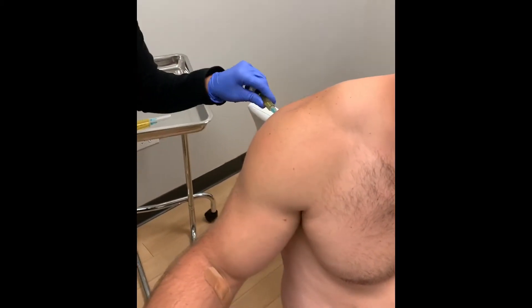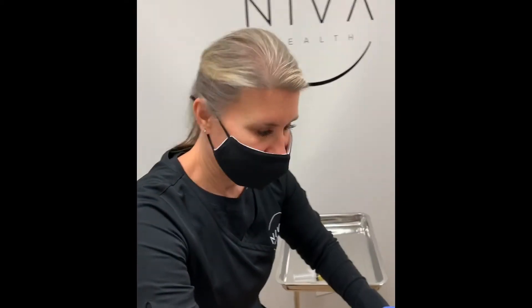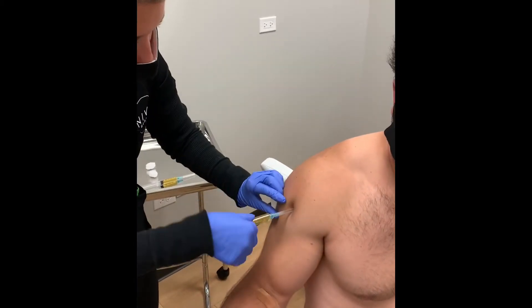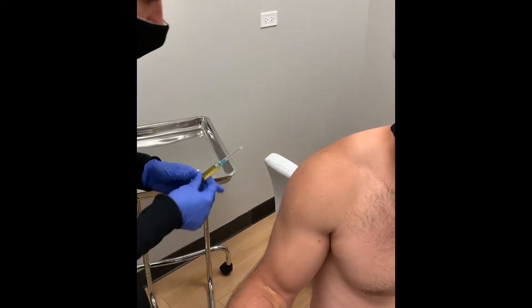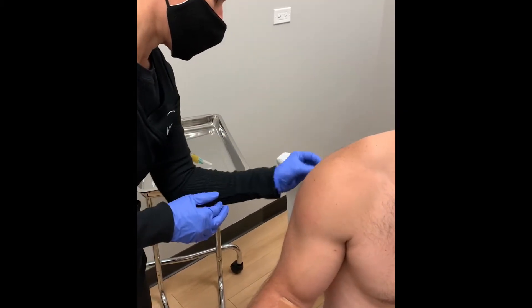This is Dr. Jason getting his shoulder injected, and Danielle, our nurse practitioner here at Neva Health, is marking the area where she's going to inject his — what we like to call liquid gold. All the growth factors, cytokines, all the things that are going to help him regenerate and repair any sort of damage.